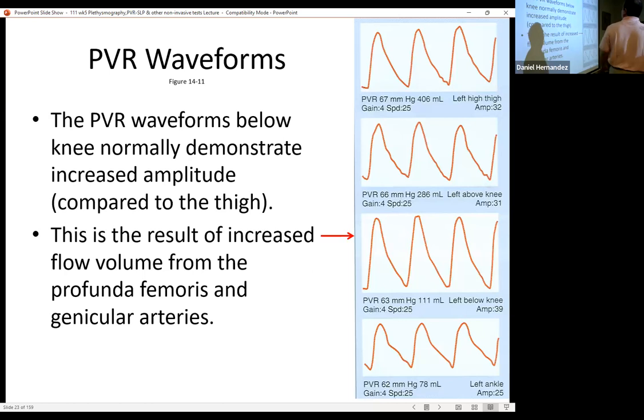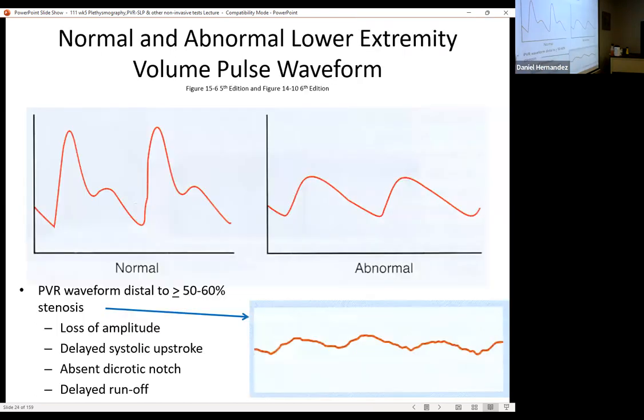Sorry, when we were referring back to the other charts, the one that you went through, mildly and so on. So this one, you were saying like a loss of diastolic flow, it looks like you're losing some of the diastolic. Yeah, I agree with you. What is that word you're saying? The diastolic runoff. Runoff, yeah, so none of them are normal.